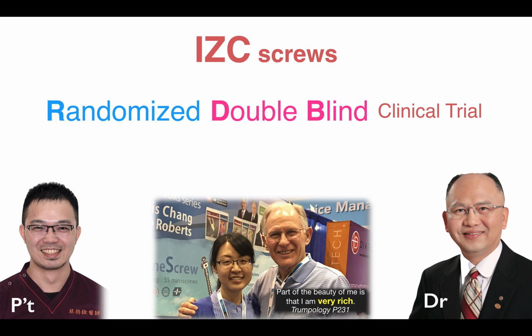But anyway, I do the study. So in order to find out the difference between titanium and stainless steel, you have to design a study, a well designed study. And this study is very difficult for me, many years. It's randomized double blind. When we say double blind, my patient and myself have no idea. If the patient asks you, what kind of study you do? Oh, it's a study I have no idea what I'm doing, and you have no idea. How can you ask the patient to sign the approval form?